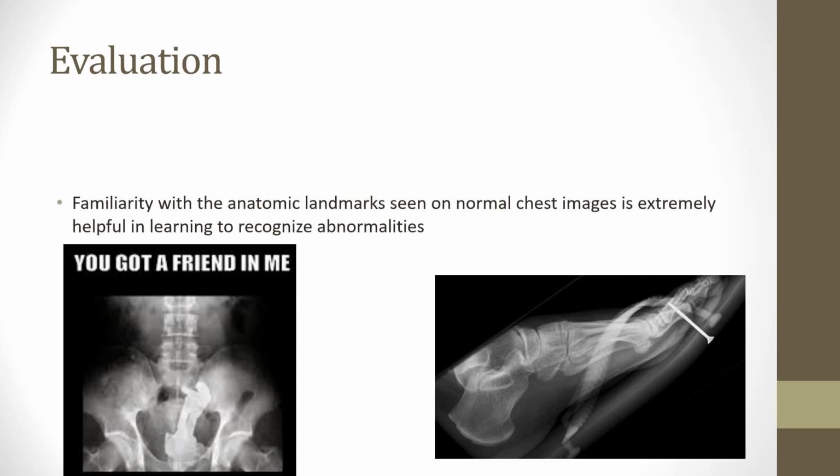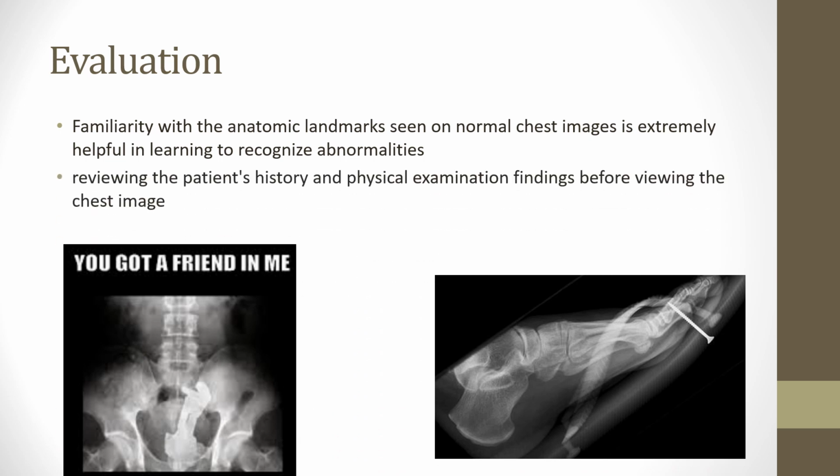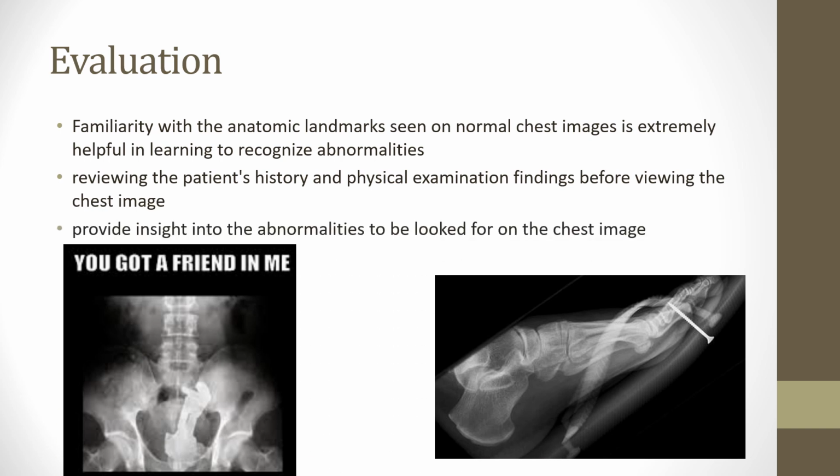All right, evaluation. We talked a little bit about this. It's making sure that you see your landmarks on these. Looking at their history and physical can help you pinpoint what you're most likely seeing on the X-ray when you're looking at it. So don't forget to look at why they're getting the X-ray, right?